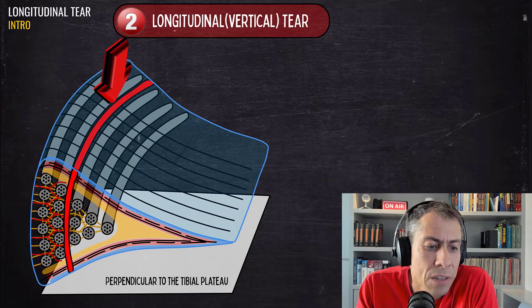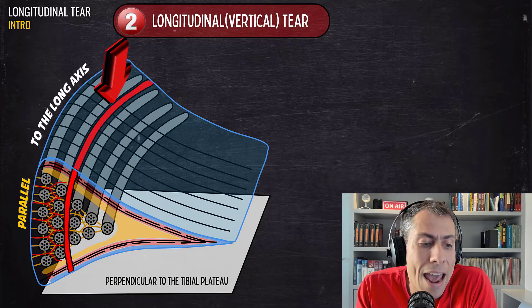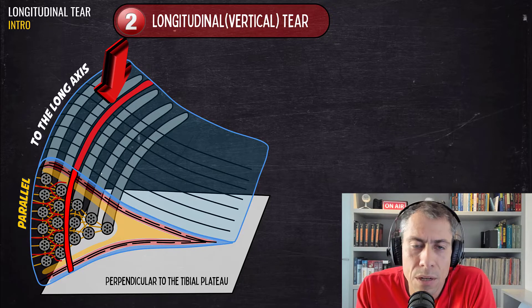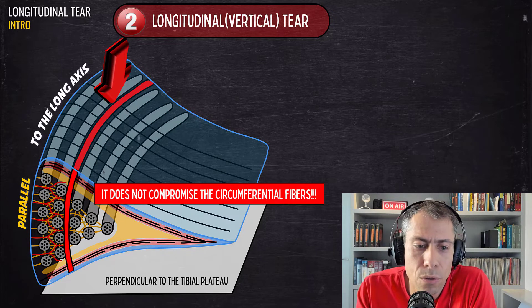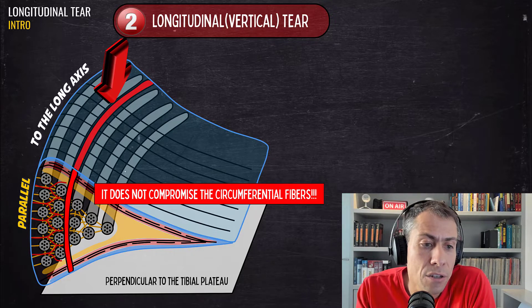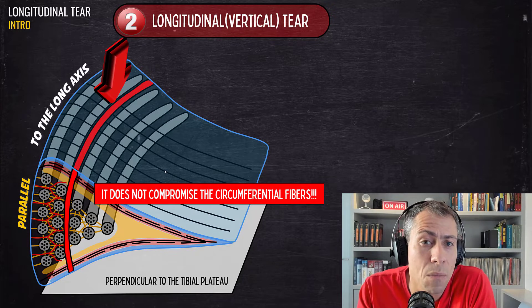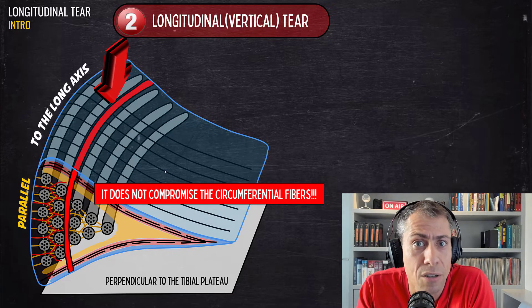The longitudinal vertical tear is a tear that is perpendicular to the articular surface, or perpendicular to the tibial plateau, and it's parallel to the long axis of the meniscus. The good news about this tear — the same thing as the horizontal tear — is that it does not compromise the circumferential fibers. So meniscal function is maintained in cases of longitudinal vertical tears, especially when the inner fragment is in its own place and has not migrated.